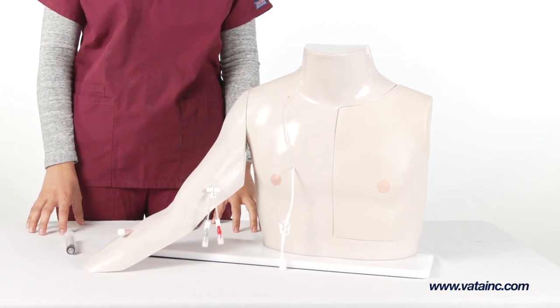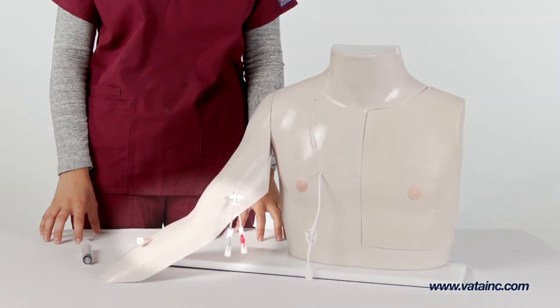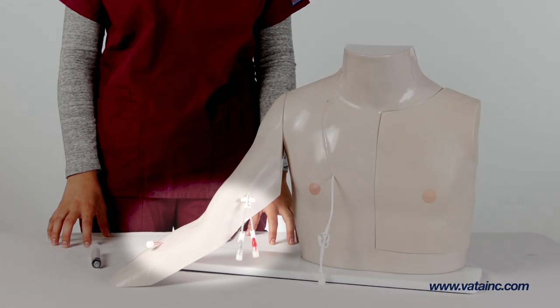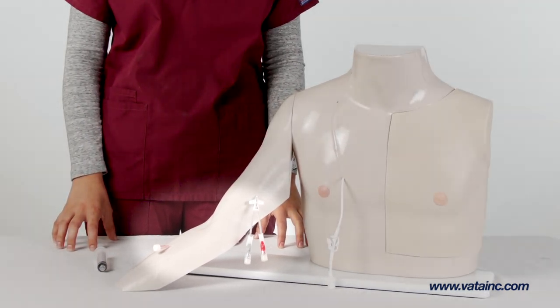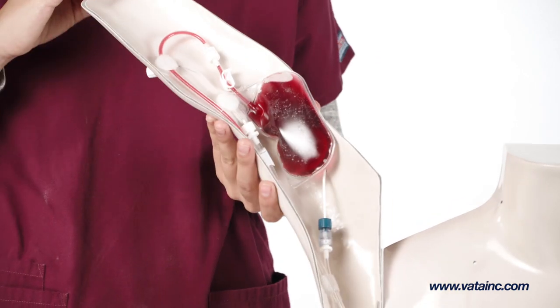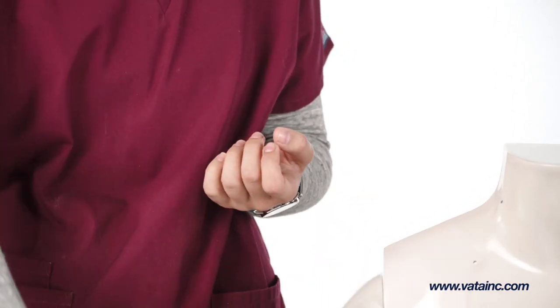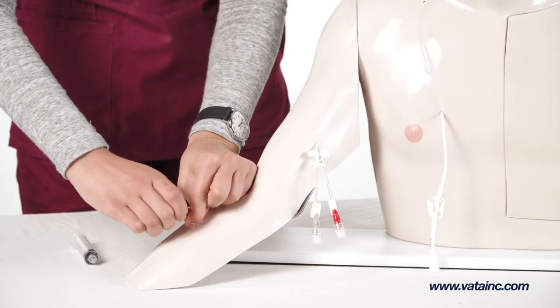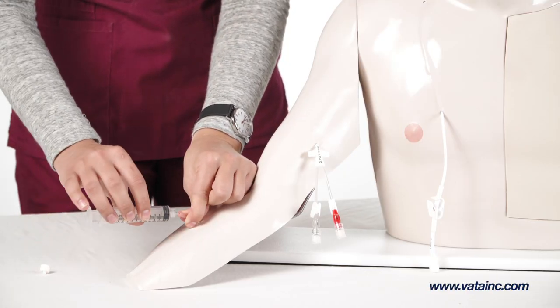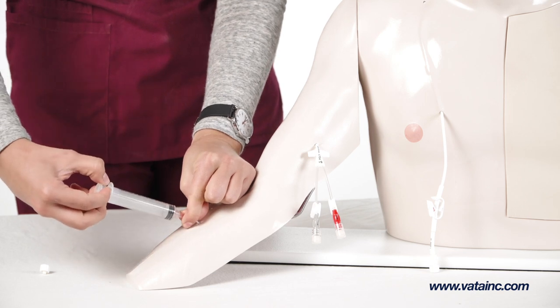To use the arm, begin by priming the arm tube. First, attach injection caps or access devices to the IV catheters and dual lumen PICC before attaching the simulated blood reservoir bag. Next, open all snap clamps on the back side of the arm and attach a syringe to the peripheral IV and each side of the dual lumen PICC. Withdraw air until simulated blood is visible in the syringe.